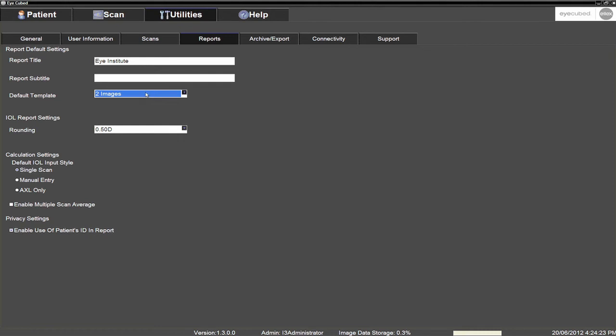Next, make sure that in the Calculation Settings section, both the Multiple Scan Average and Enable Multiple Scan Average options are selected. This will ensure that the average of all axial length measurements is used to calculate the IOL power in biometry mode.